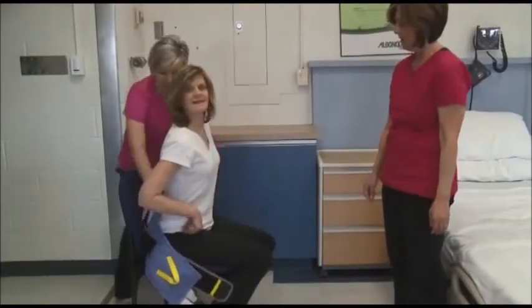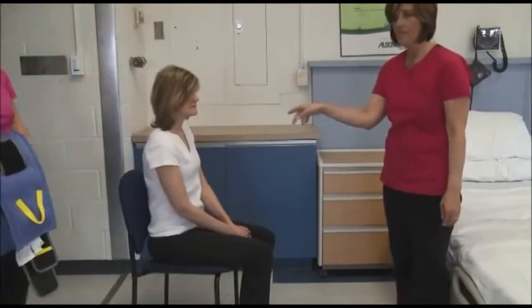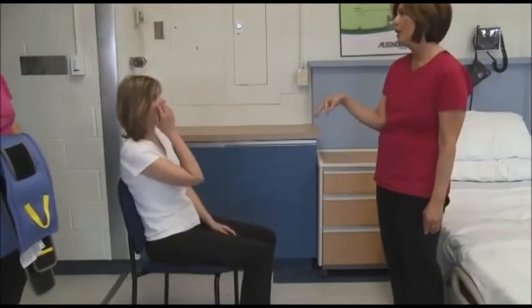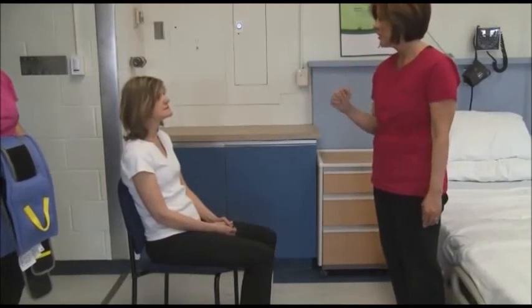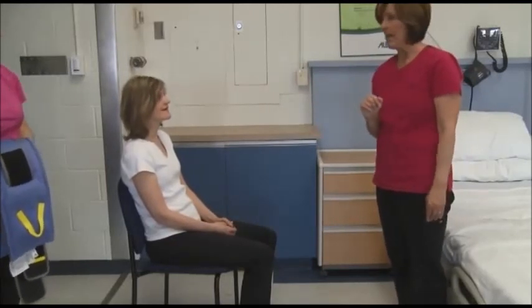There you go, Carmen. Now, in some instances where the client may just be sitting on a commode chair or a toilet, we might choose to leave the belt on, but in this situation, Carmen would like to sit in the chair for a while and does not need to have the belt on.